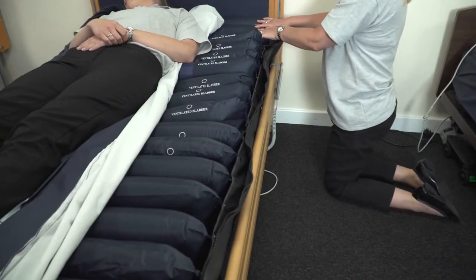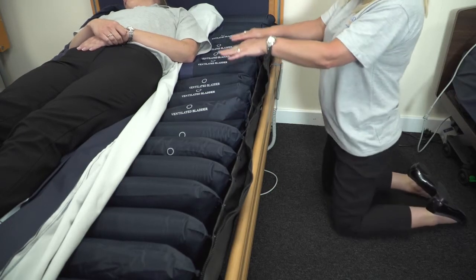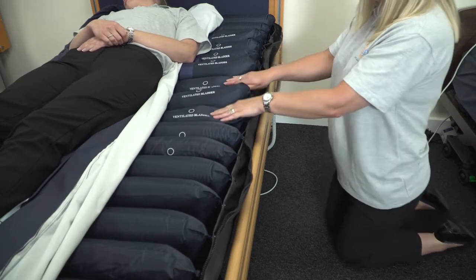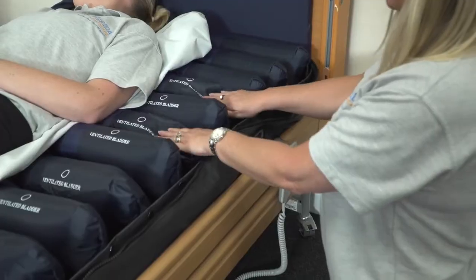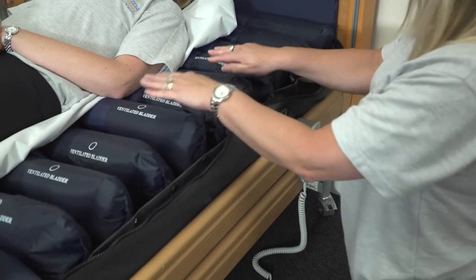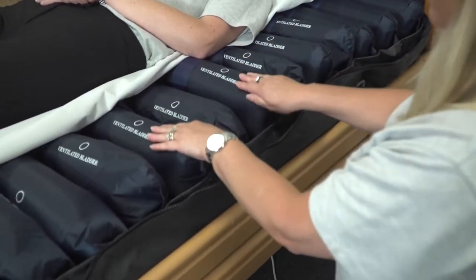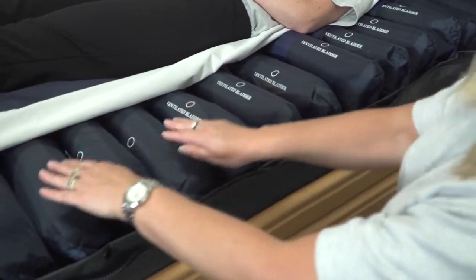The product operates in a 1-in-2, 11.5-minute cycle. The cell construction consists of 3 static head cells. The remaining 15 cells will alternate during the cycle: the first set will deflate for 5 minutes providing relief, then equalise for a minute and a half before the second set of alternating cells deflates for 5 minutes, completing the 11.5-minute cycle. The ventilated cells provide a cooling support surface for the patient's skin, creating a microclimate which helps prevent the build-up of heat and moisture.